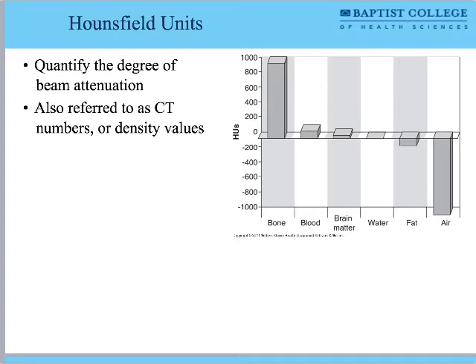Like if we look on page 7 in the textbook, we see an excellent illustration of where the Hounsfield units would help us out. We have the patient's body without contrast and the patient's body with contrast. We can see that the kidneys appear brighter on the image. Their Hounsfield unit would be higher. They are attenuating more, and that's why they're showing up brighter on the image.